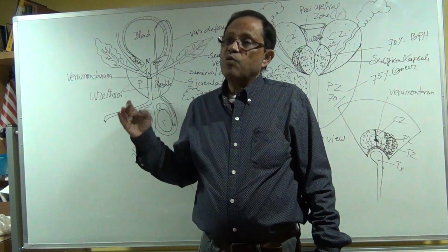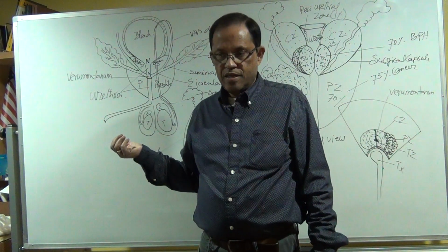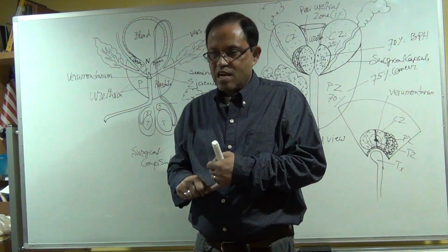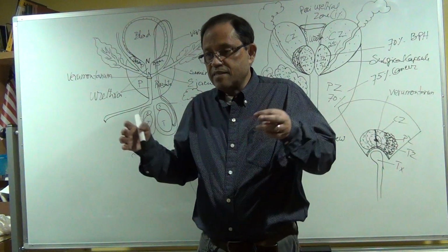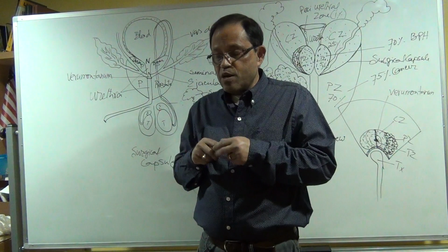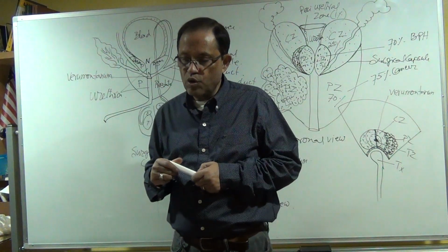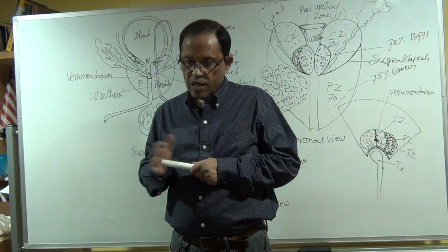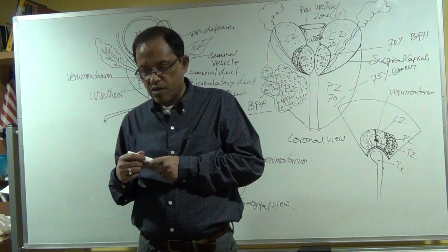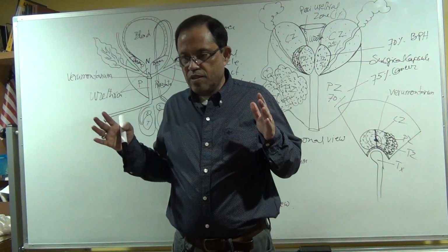Then what is the scope of ultrasound use in the prostate gland? Number one, somebody has a BPH, follow up. Follow up what the size is. Size is getting bigger. And usually for the prostate gland, write down, the volume is very important. The doctor goes by the volume. Usually 15 to 25 cc, cubic centimeter, or grams. 15 to 25 is normal.